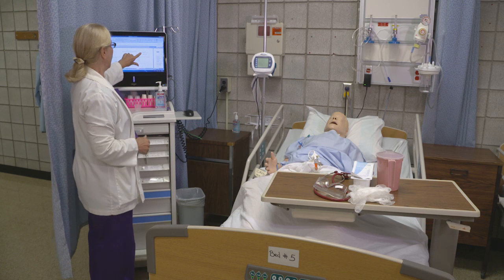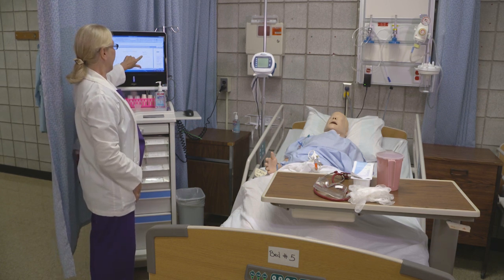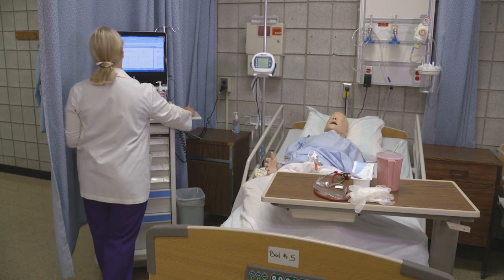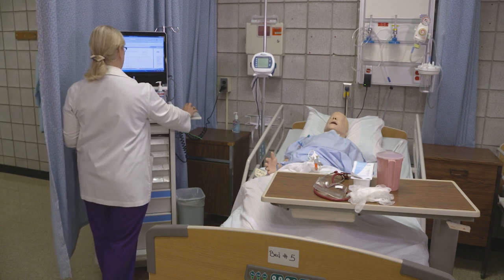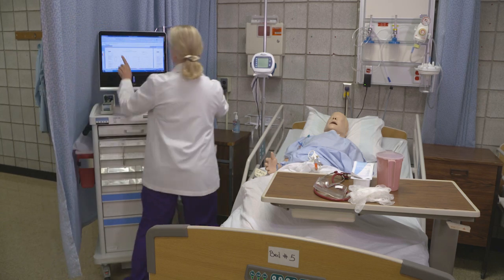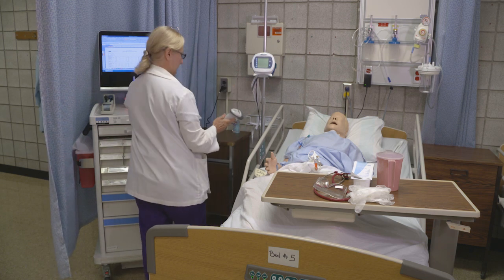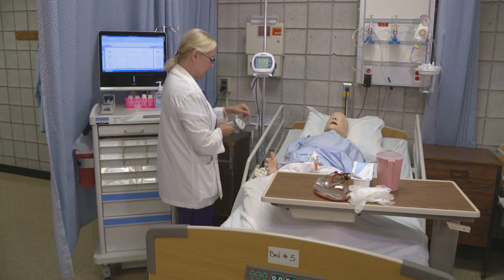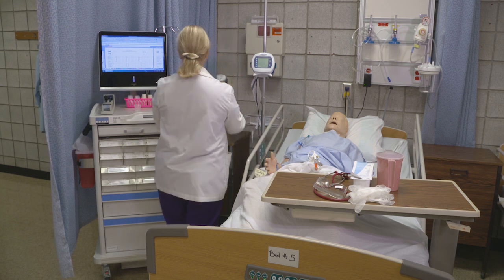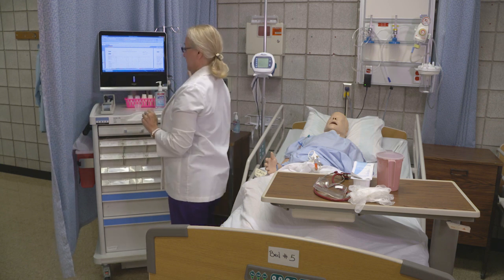Sally Wright. Date of birth? 5/27/1950. Any allergies? No, I do not. Good. Check the MAR screen and make sure that the cursor is in the upper left-hand corner and highlighted before scanning the bracelet. Can I see your bracelet, please? Once scanning, the word no changes to yes. This lets you know that you have the correct patient.